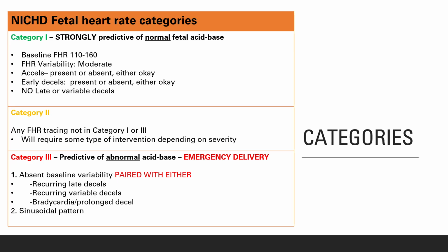So you may see this on the unit as we're documenting our fetal tracing. The nurse has to document their overall assessment as to category 1, 2, or 3. So again, this is just an FYI.